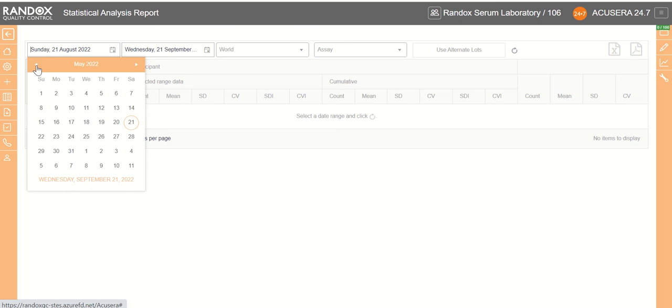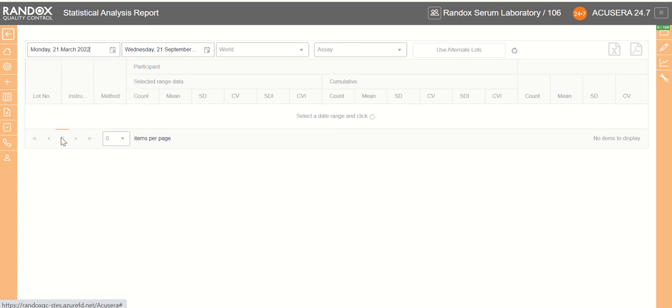So we select our date range, and we will go back to March till September, and we'll look at the world peer group and we'll look by assay. And once we're ready, click our little generate button.